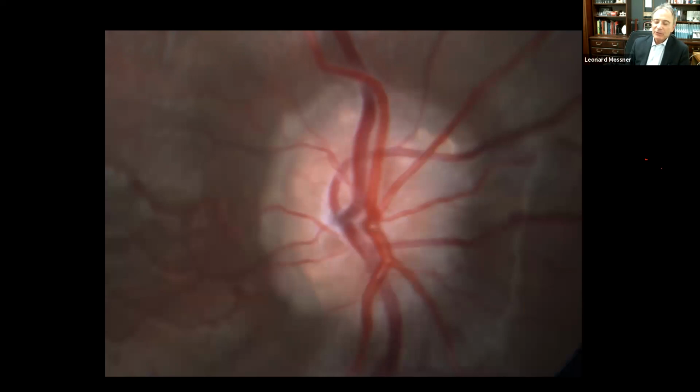So before we even get to the presence of the Drusen, the first thing that you can see is that there's pretty much absence of the central cup. Second is there's pretty good color to the optic nerve. There's reasonable pinkness. There's really no significant obscuration to the major retinal blood vessels, either on the surface of the disc or away from the surface of the disc.